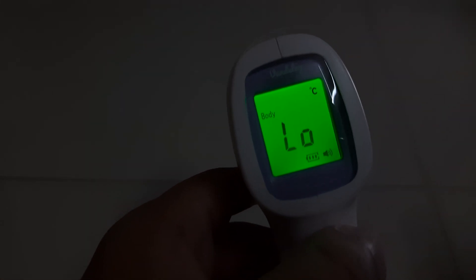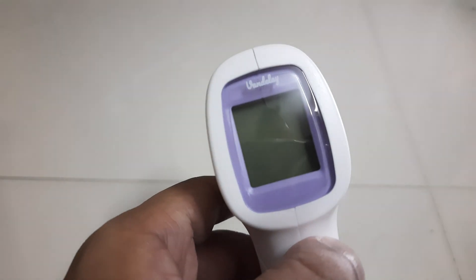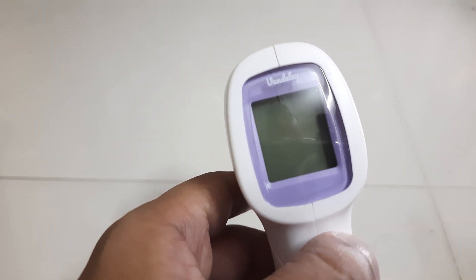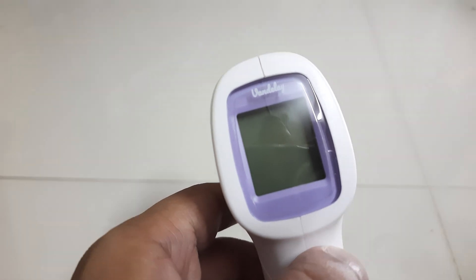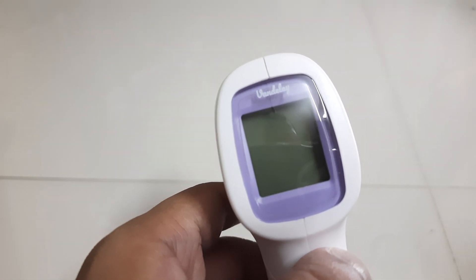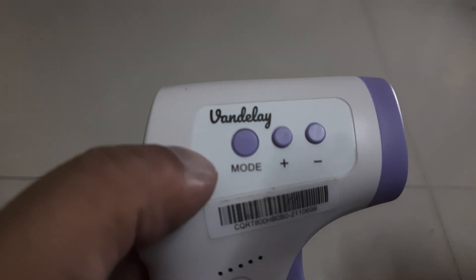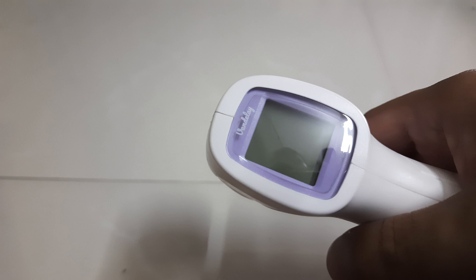This is how it gets activated. Right now I have it set to centigrade — you can use it on Fahrenheit also. I'm well-versed with centigrade so it was easy for me to change it. You can switch from centigrade to Fahrenheit or vice versa using a combination of these three buttons.